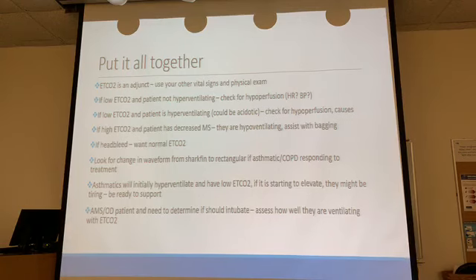In a head bleed, let's say you're transporting a head bleed and they've intubated the patient, you want that patient to keep a normal end-tidal CO2. So use the end-tidal CO2 to make sure you're not hyperventilating them or hypoventilating them, because either of those is bad for head bleeds. You want that end-tidal CO2 to stay between 35 to 45.